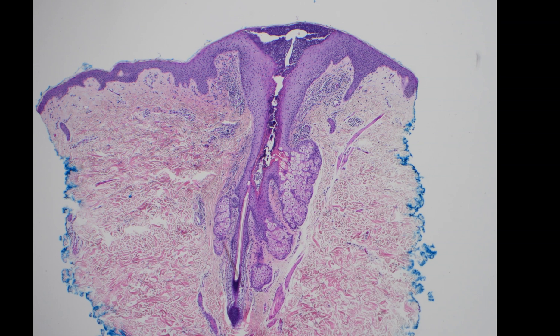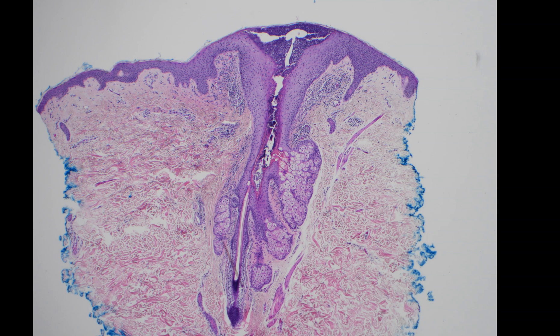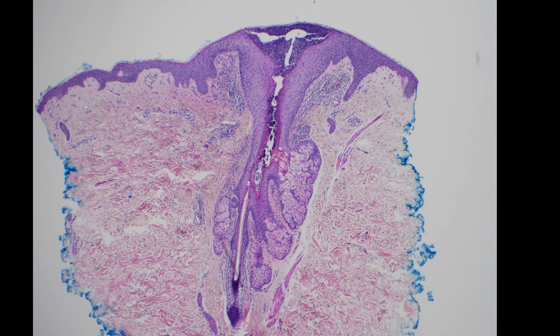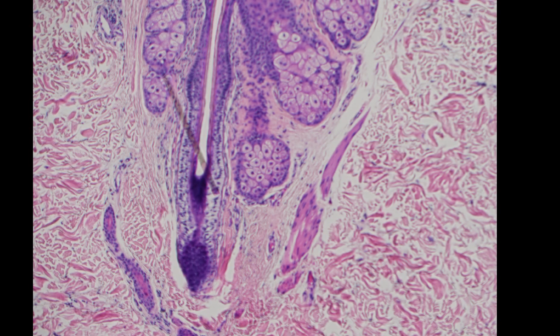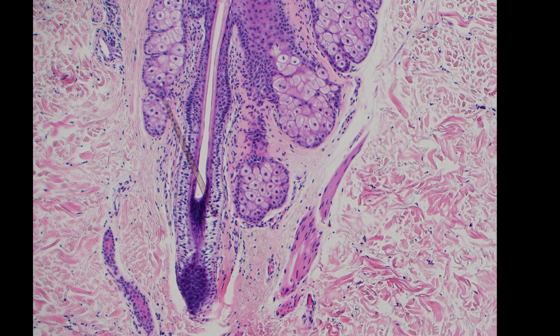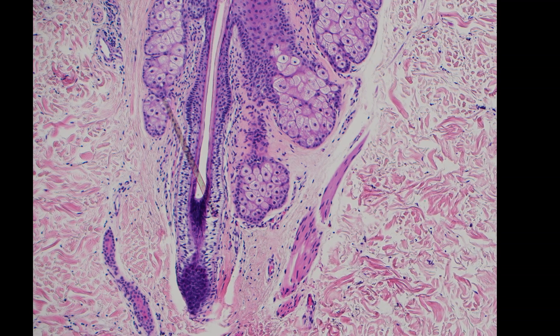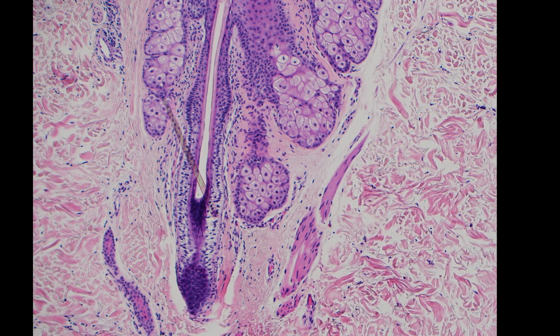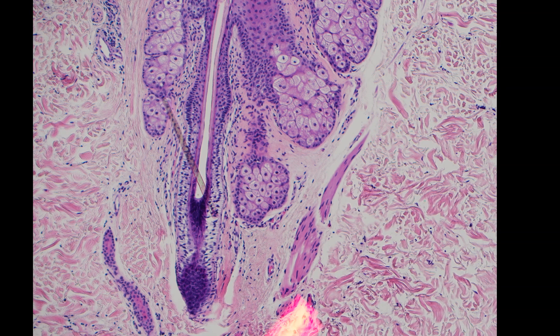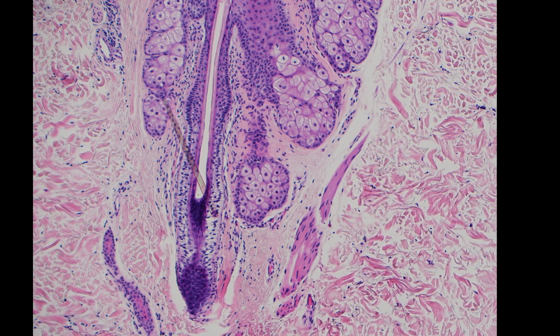They're kind of fragile, and they break and pop out of the section when we section the tissue sometimes. I'll show you right down here — you can see an example. There's the hair shaft sitting kind of on top of the tissue. Normally, it would go right into the lumen, and right there is where it belongs.